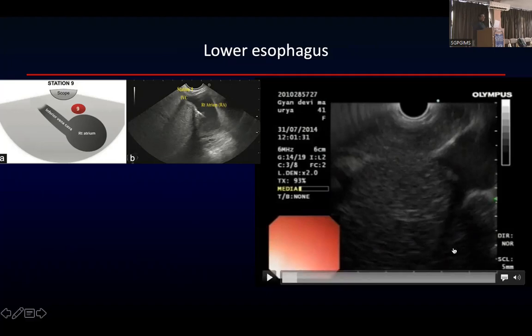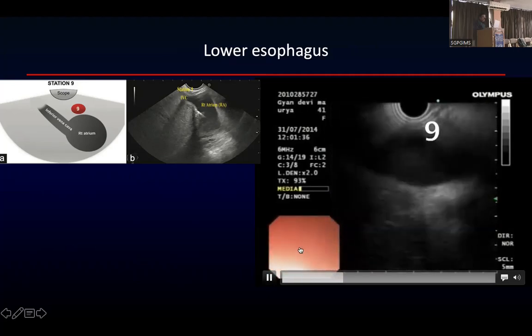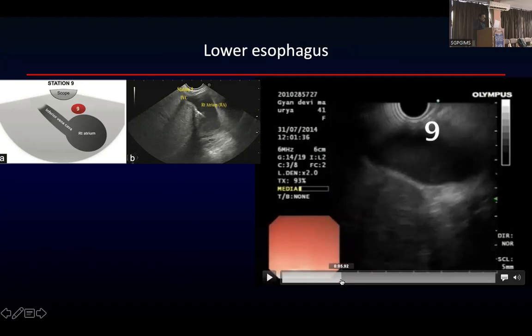Okay, so this is RHV, this is 8, this is 1, this is 7. Is that clear? There is no doubt about it. Once you figure out RHV, you can figure out which liver segment it is. 1, 8 and 7. Then what I'll do here is I'm just following this. This is IVC, so this video is not very good. Now this is IVC going into the right atrium. This is obviously not the station, this is the vessel.